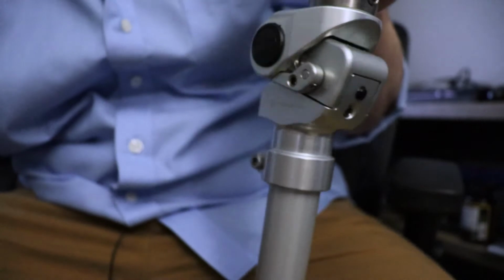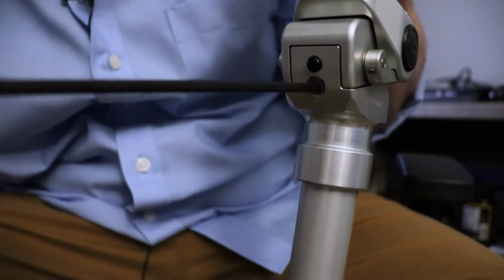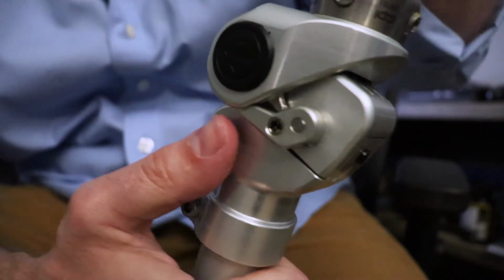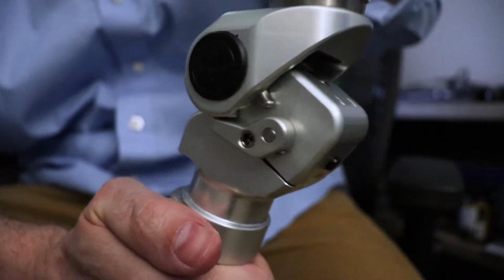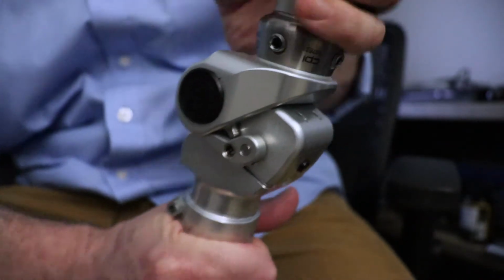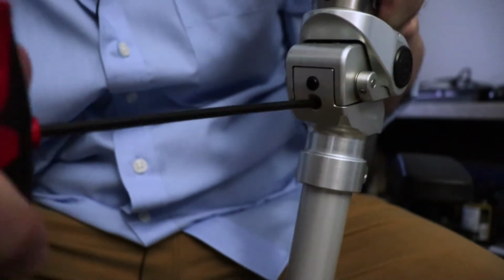Now I want to show you what happens when I take away that stance flexion. Now if I turn this clockwise to the right, I'm removing that stance flexion from the knee. So I went about halfway there. Now I'm going to try to unlock it. Okay, it still goes, but the knee is more difficult to unlock, and it moves slower. So let's go all the way. Remove the stance flexion completely.